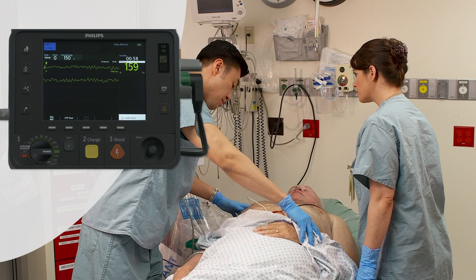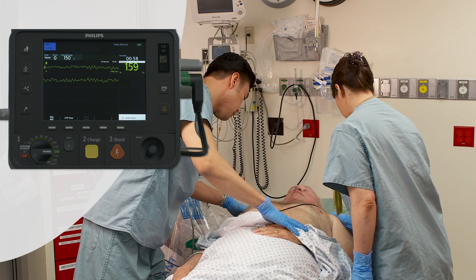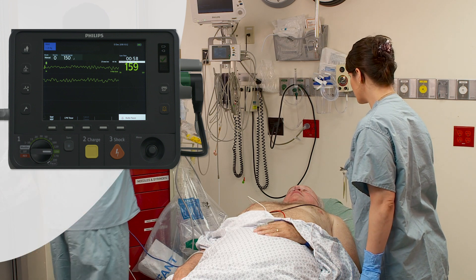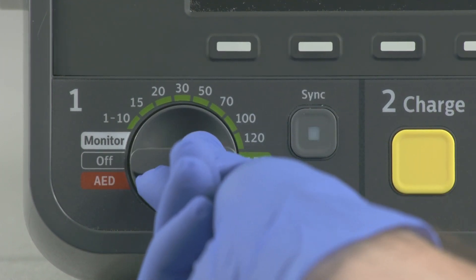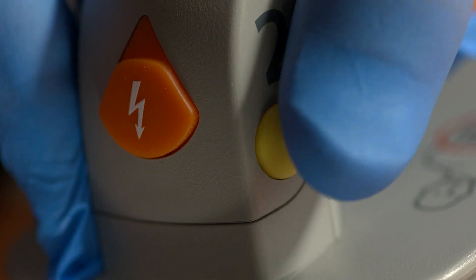After assessing your patient and determining that defibrillation is necessary, connecting the paddles cable to the device and applying the paddles to the patient's bare chest, set the therapy knob to the desired energy for the patient. Then, press the charge button on the paddle.